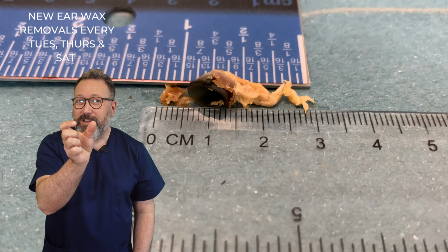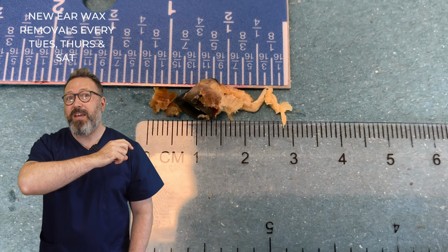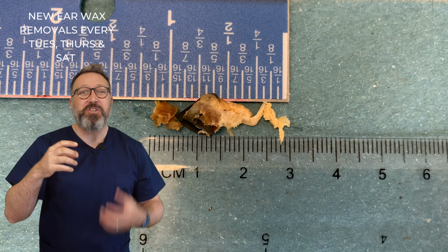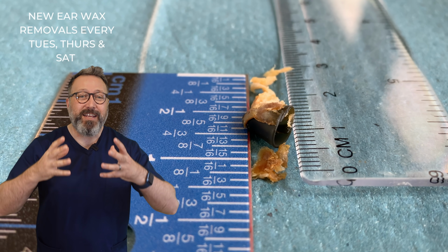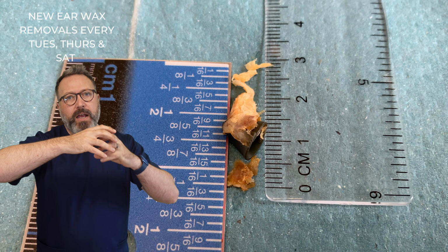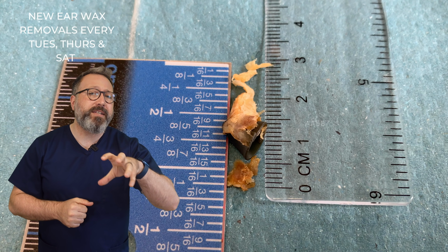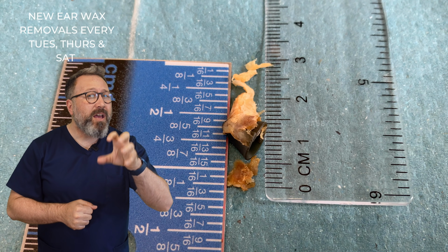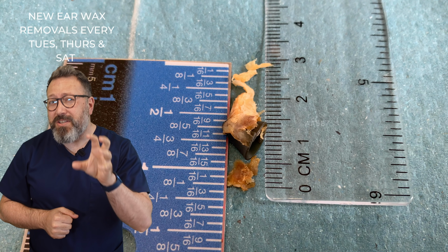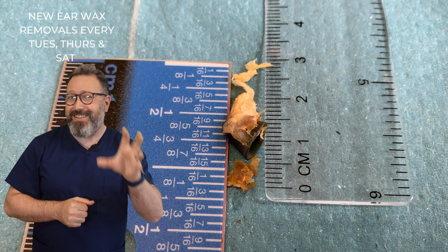So there's the object at the 1 centimeter, the 7/8 of an inch mark. All of that to the right hand side was what came out attached to the back end of it. So you can see just how much dead skin had accumulated. It is almost fused around that object and attached itself to it. So your patient was really lucky they came through when they did. If this had gone on a lot longer, this patient would have ended up with a really nasty, serious infection sitting behind that, which could have caused some damage to both the ear canal and the eardrum itself.